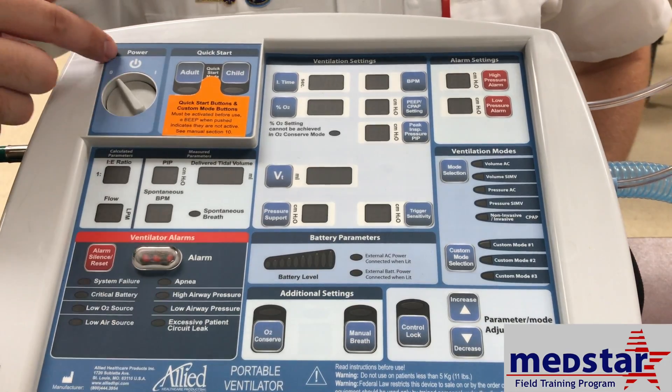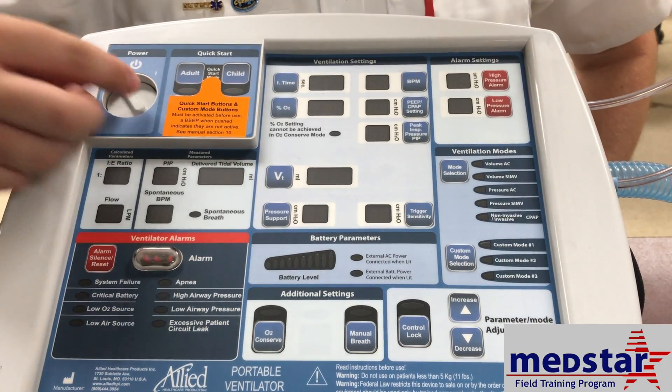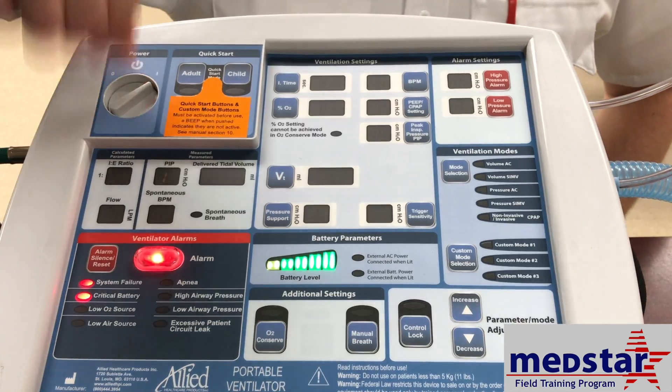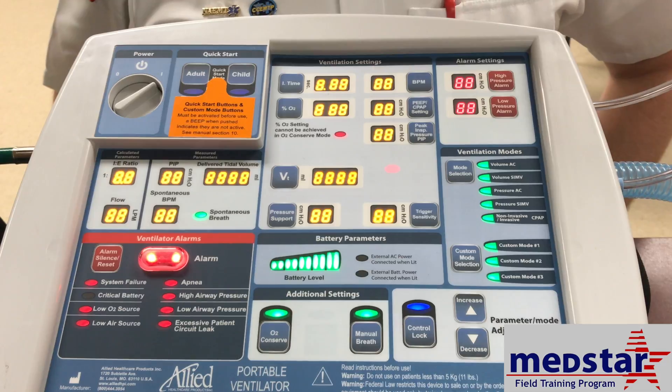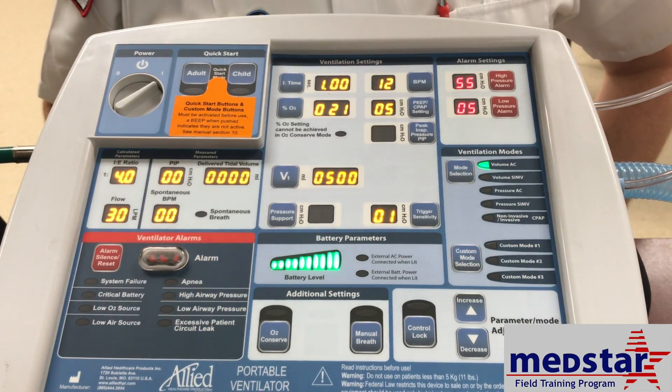Now we're going to go over how to turn on and input the settings for the AHP 300 ventilator. First, you turn it on — the power switch is up here, you just switch it all the way over to the other side. It will do a quick self-check and the ventilator will turn on.